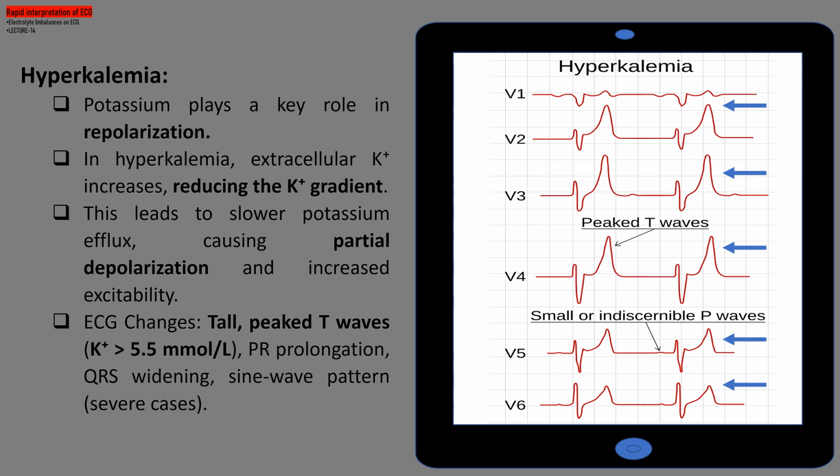Do you remember which part of the ECG wave represents repolarization? The T wave. Now recall, which ion plays a major role in repolarization? Potassium. Normally, during repolarization, potassium moves out of the cell, restoring the resting membrane potential.